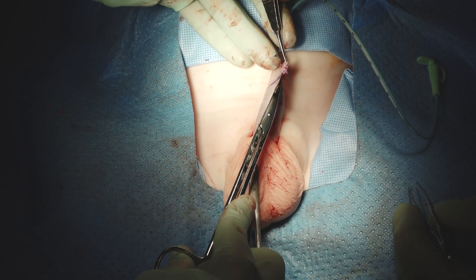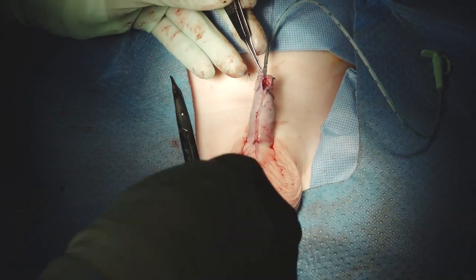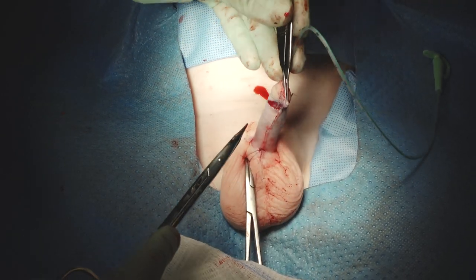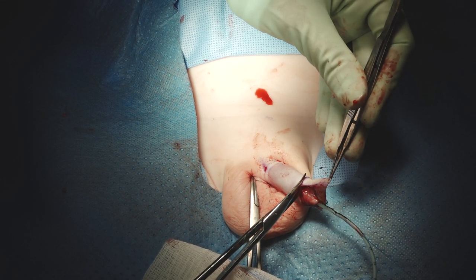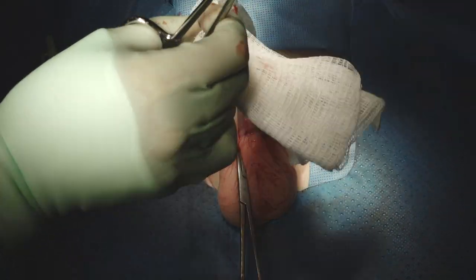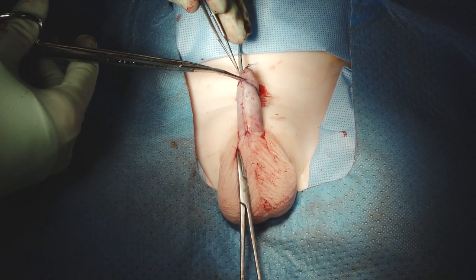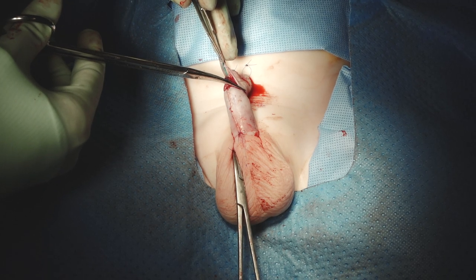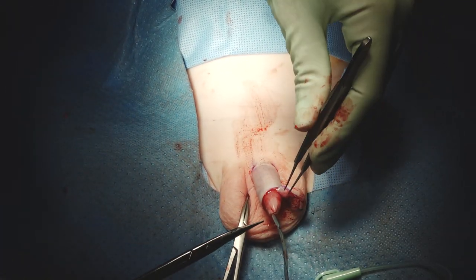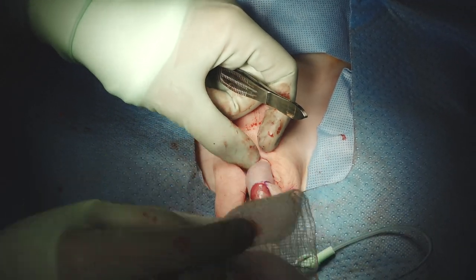We'll go up just a little bit to get rid of that last little pump. This is a good way to double check — you can see your glans back there. You want to be sure you don't cut to your mucosal collar. We're leaving it just a millimeter or so longer so we don't cut it too short. I also like to bring this dartos up just a little bit and cut that off, because sometimes that's tethering things just a little bit back here.